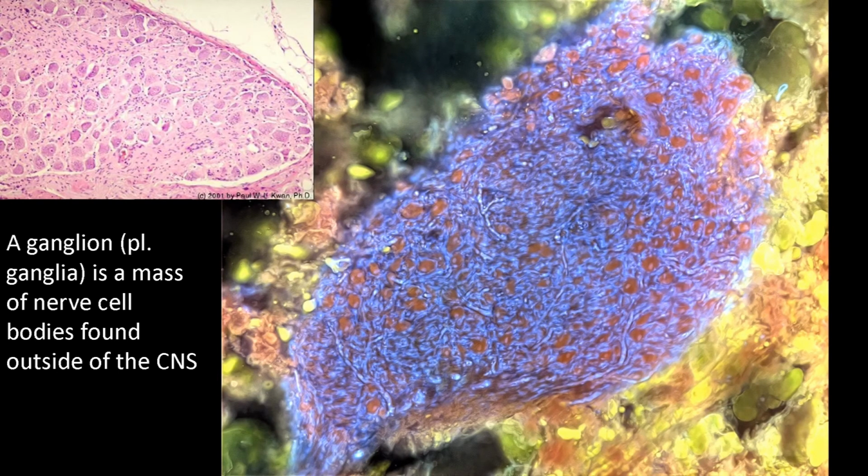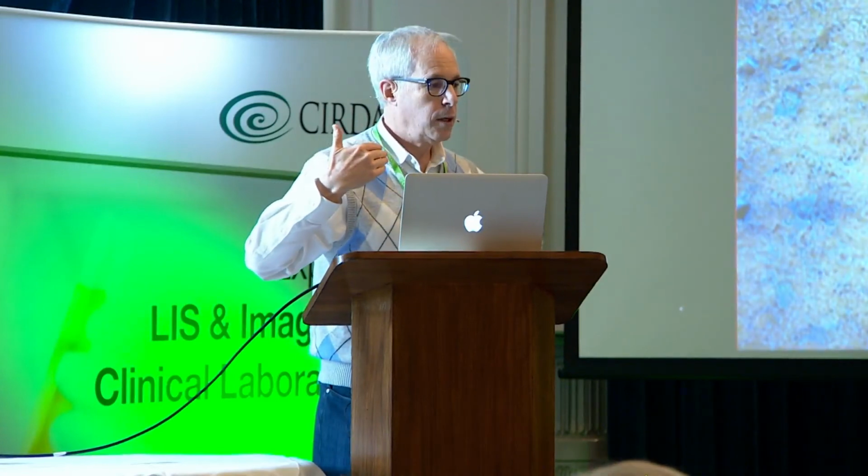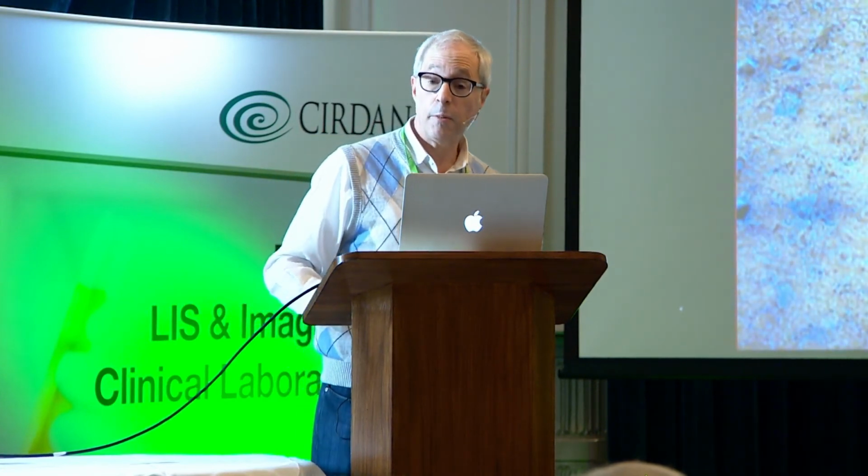So I think my last slide from the MUSE part of this story is to show you a direction that we're going in. This is very preliminary, but because MUSE has limited depth penetration, you can do serial block face imaging and get indefinite 3D images of structures. I overheard you talking about looking at glomeruli. We should be able to section through glomeruli and get a 3D view of them, because we can section 5 microns and image every time. And so here is a rather gross series of slices.